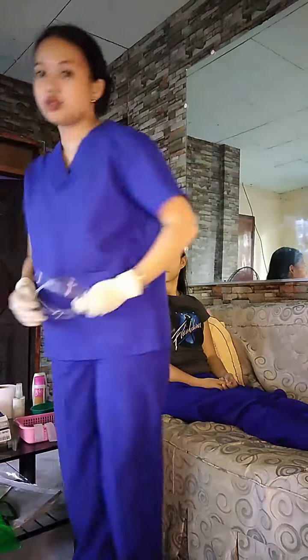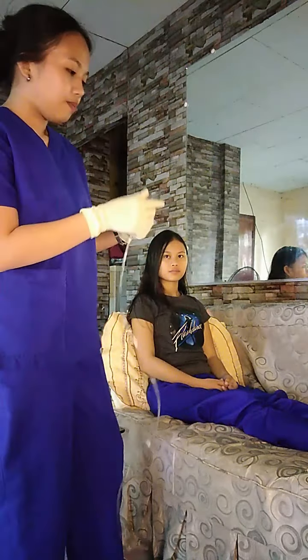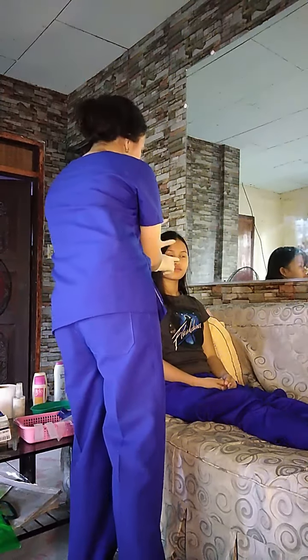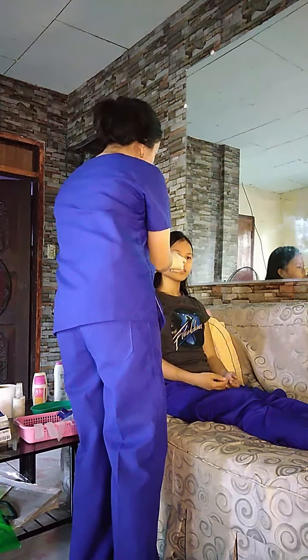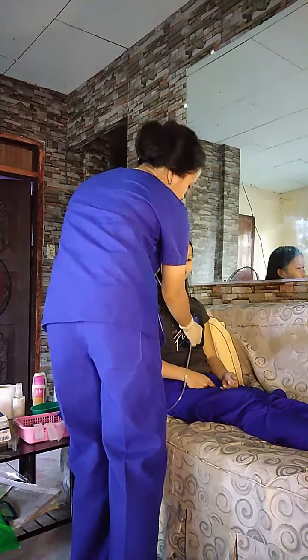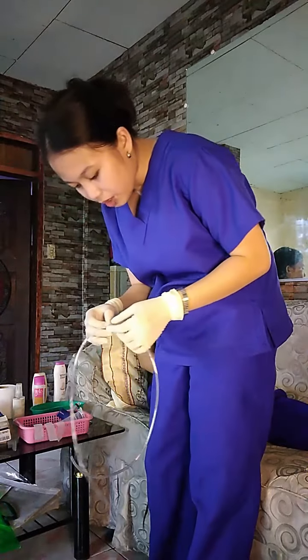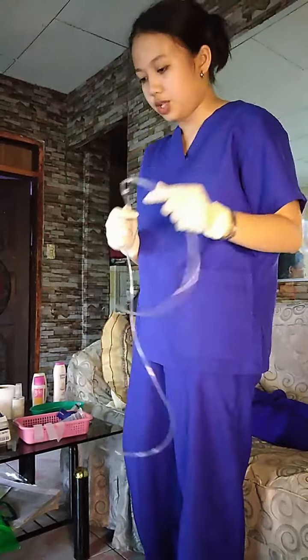Pagkatapos nun, ang sunod kong gagawin is i-measure ko na yung insertion length. Measuring the insertion length, I will start from the tip of the nose, and then towards the earlobe, and then towards the xiphoid process. So, ayan, bago ako mag-i-insert, imamark ko muna. Pagkatapos kong i-measure, imamark ko na using a tape yung insertion length.